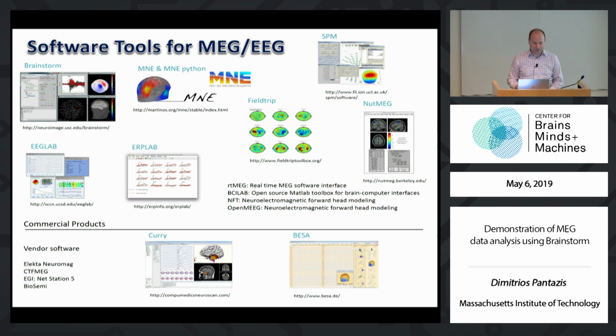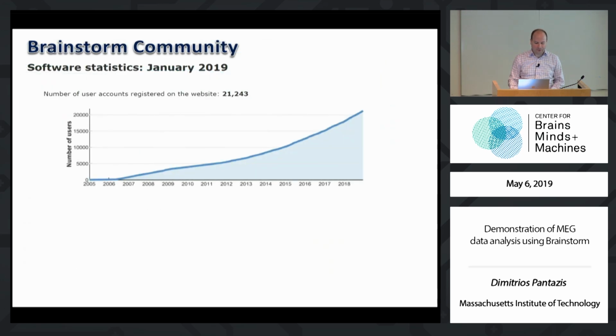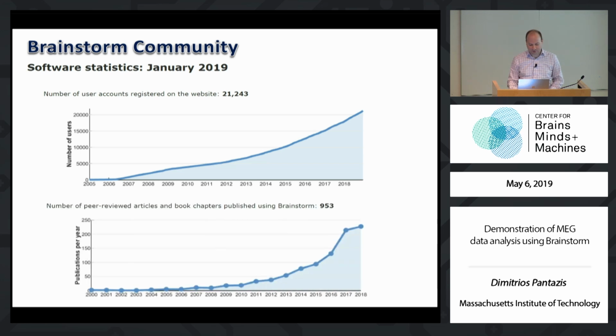to analyze their data. And today I will discuss Brainstorm, as I mentioned. It is actually quite considerably used. These are the number of user accounts registered on the website. And it doesn't mean that every single user is actually doing anything useful with the software. But some of them do, because they're actually publishing papers with the software, so that's really good.